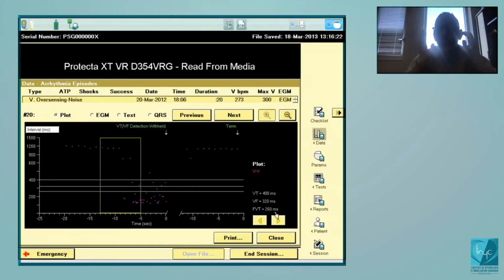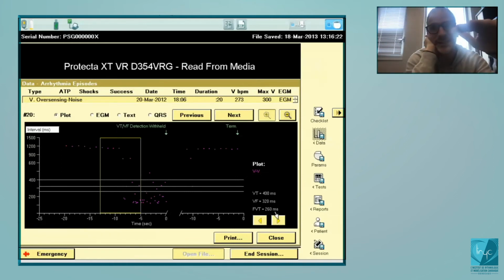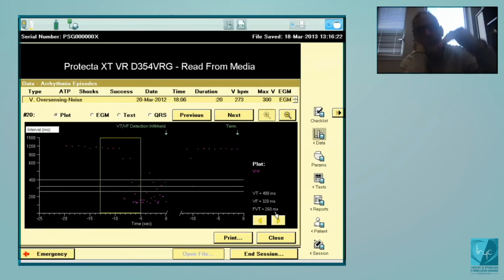I will not give you all the details, but the device will measure the impedance every day, and it will calculate the average value over 13 days. Then if the value the next day is more than 150%, 175%, or less than 50% of this average value, that's going to be one. So if there is an abrupt change in the value of the impedance. Okay, that's parameter 1.